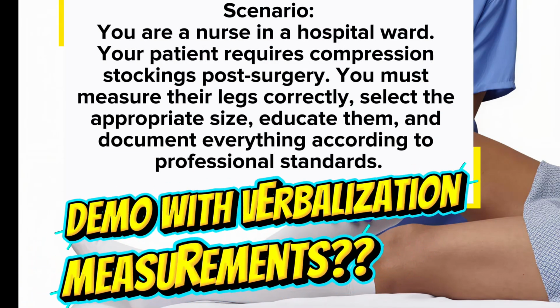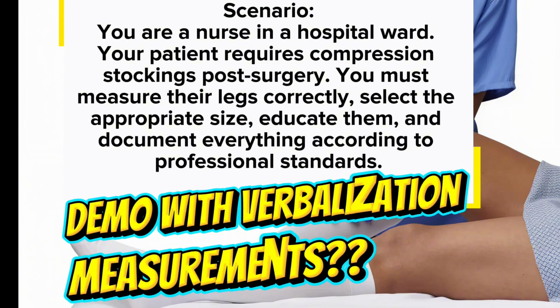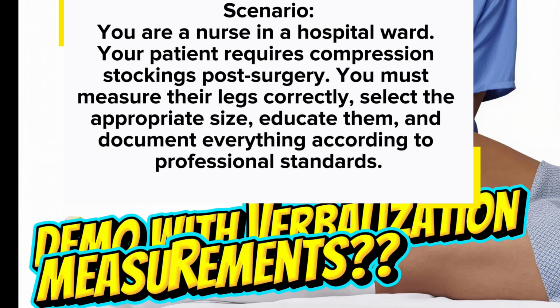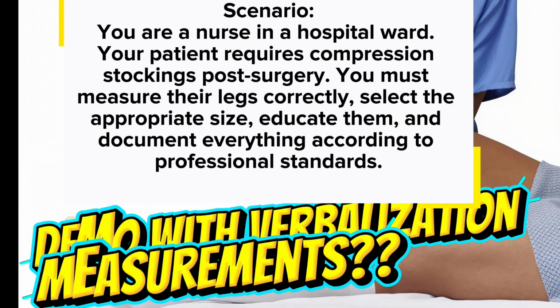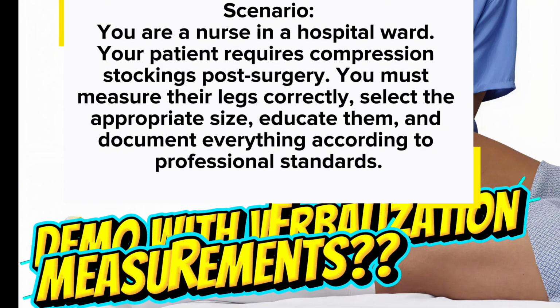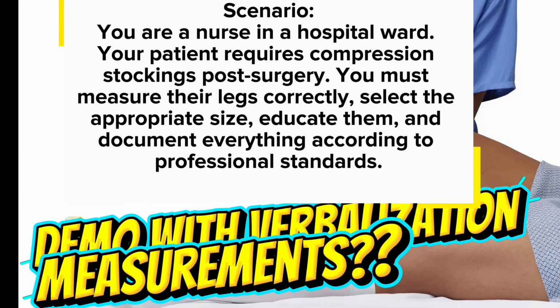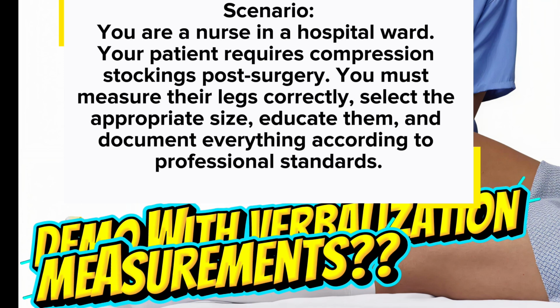In today's video, we are going to cover an important and new NMC OSCE clinical station with a complete exam scenario along with the ready-to-use script that you can follow step by step during your OSCE. We will also cover how to measure correctly, select the right size, apply the stocking safely, and what examiners are looking for to give you full marks. So make sure you watch till the end because this will really help you feel confident for your exam.